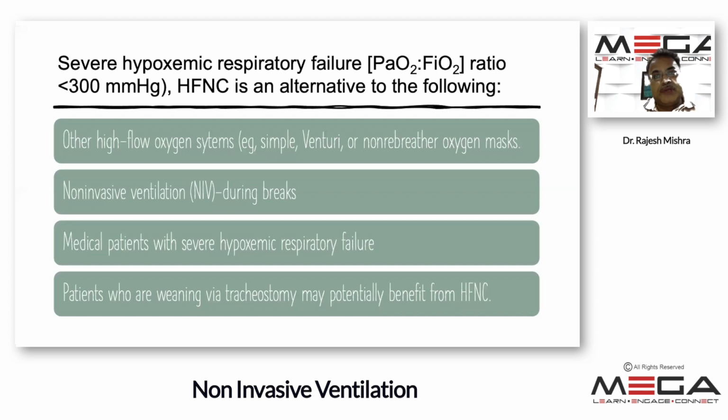giving more comfort to the patient. It even avoids putting the patient on NIV or ventilator support, and it has even helped us in reducing the secondary complications. So wherever you get an appropriate patient, particularly hypoxic patients who are mild to moderate, who are tachypneic, use of HFNC in a given set of COVID respiratory failure, in a given set of acute LVF, or even in a given set of pneumonic respiratory failure, or any hypoxia, particularly non-hypercarbic hypoxia. HFNC is always a good option in a given setup.